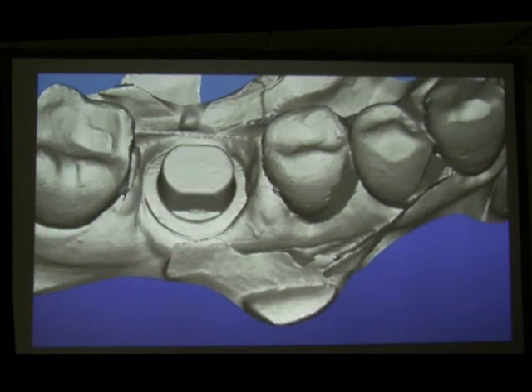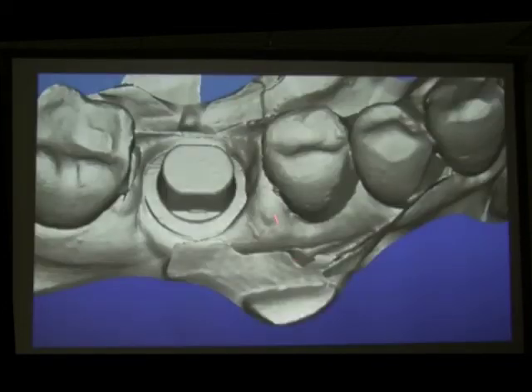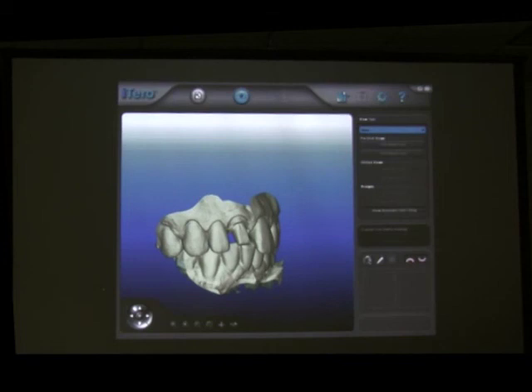You can do what we call platform switching. We can make the crowns narrower. We cannot make the crowns bigger, but we can make them narrower, and no problem. The thinness of areas, 0.5 millimeter in zirconia, nowadays is not any contraindication for us. And of course, it's not 0.5 millimeter all the way. It's 0.5 millimeter in certain locations, which is not an issue.